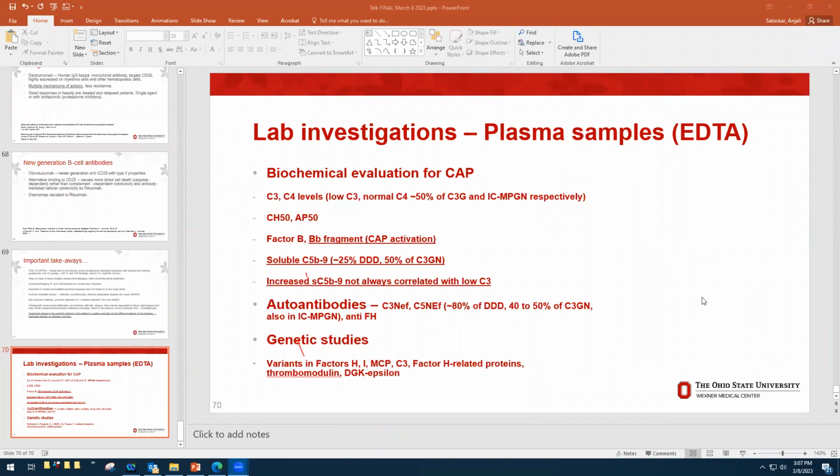Okay, the second thing is the EM. I have a tendency that when we see these subepithelial humps, with the presence of subendothelial deposits, and they did look in the early biopsies a bit like really a hump, and with such a bright C3, to go more for a C3GN. But you seemed more inclined that you could have had a superimposed infection rather than this being part of the C3GN. No, actually, infection was never considered.